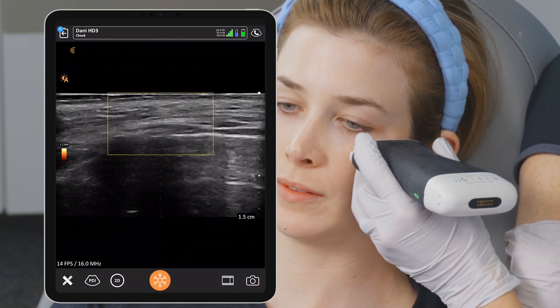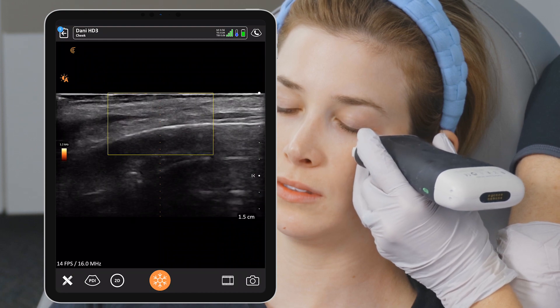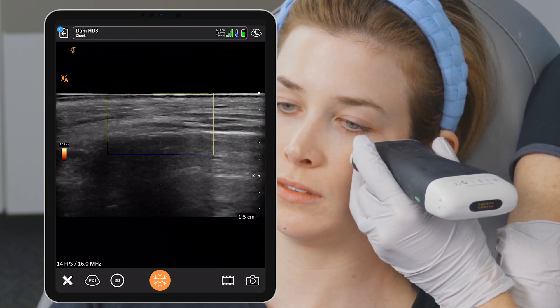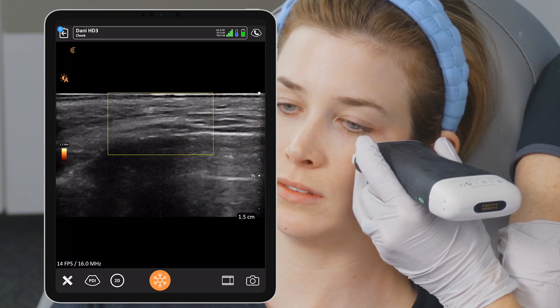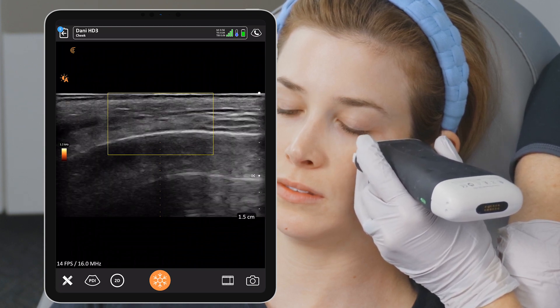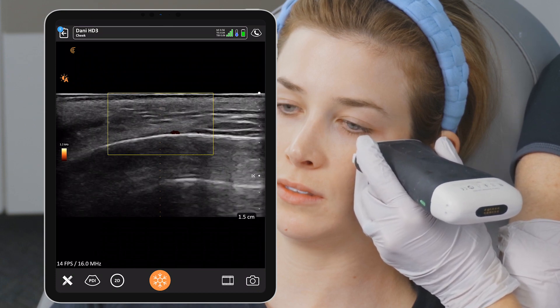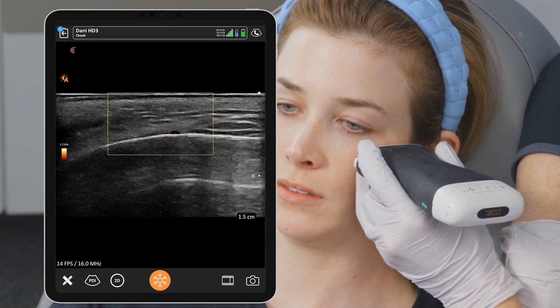The next thing we need to do is check pressure. Here's a dense pressure — you can see I'm pushing and we're looking at the screen — and then a lighter pressure. Your view changes with your pressure. You always want to use the lightest pressure you can when you're talking about such superficial vessels and superficial structures. So that was our pressure check.